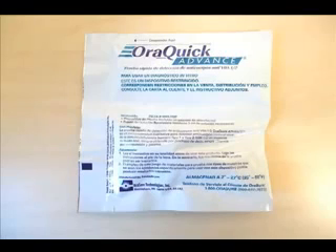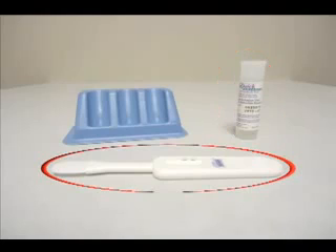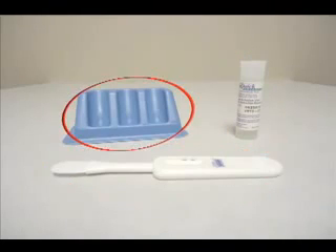We will demonstrate the oral fluid procedure. The materials needed for this test, which are included in the AuraQuick packet, include the developer solution bottle and the test device. Additionally, you will need the reusable test stand.